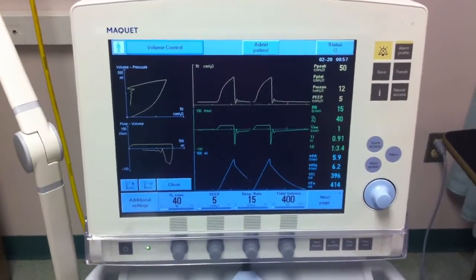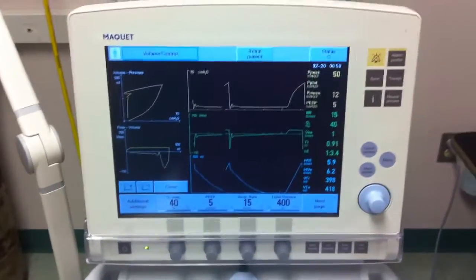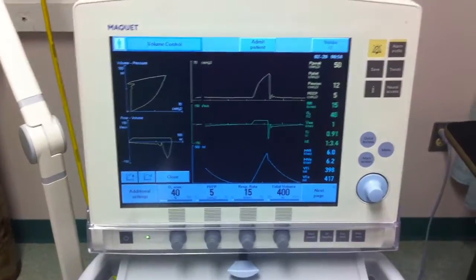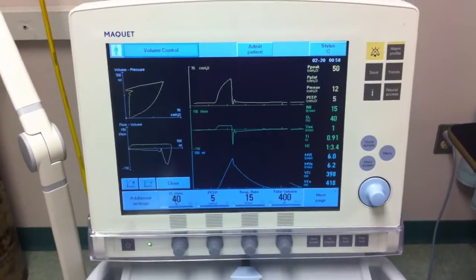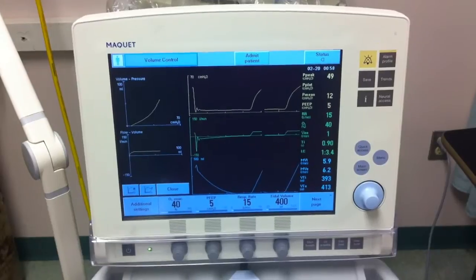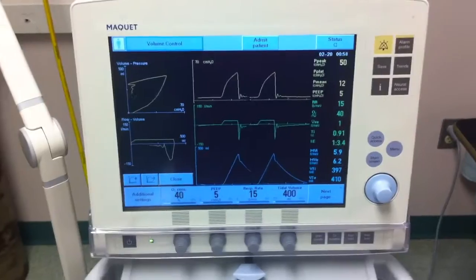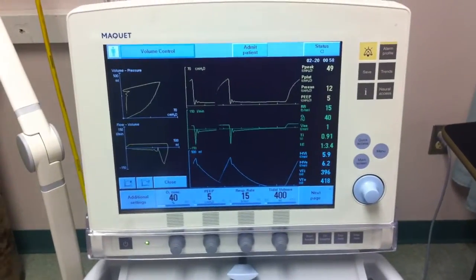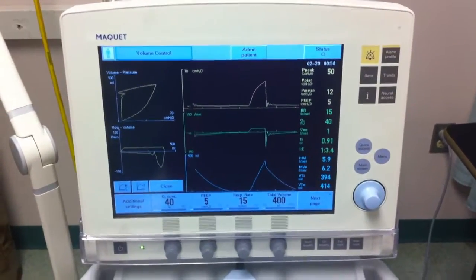Case study number 2. Case study number 2 is a 15-year-old male patient who has a history of asthma, was found unresponsive during a soccer game, unknown history of present illness other than being found unresponsive, and with irregular rapid labored respirations. Rapid sequence intubation was performed on scene by EMS, and you have been called to transport this patient from the scene to a definitive care facility.